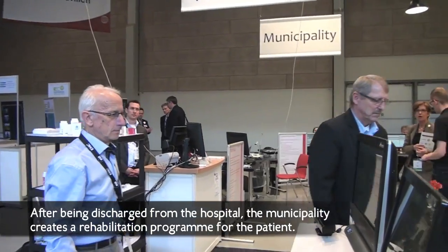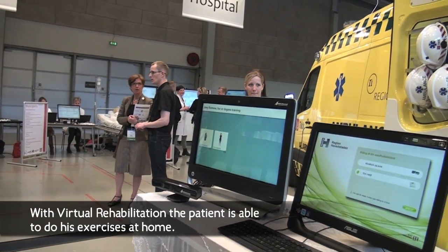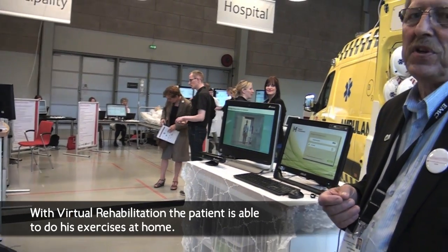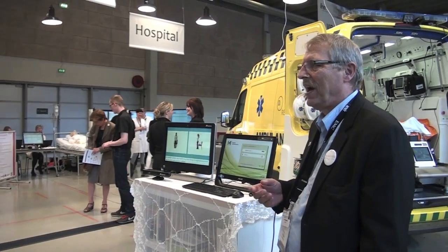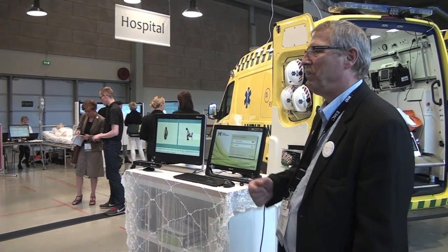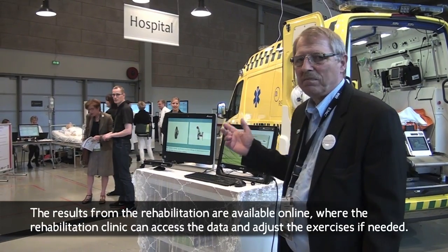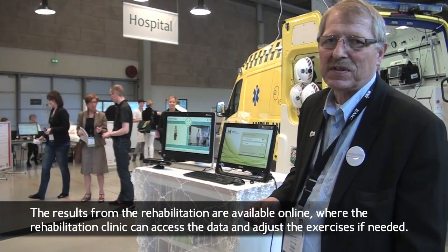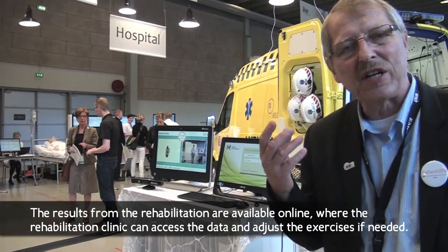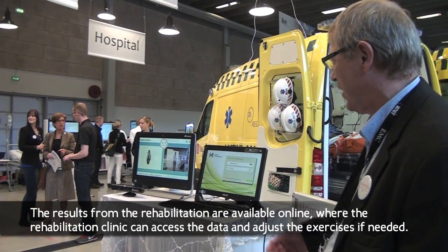Goddag. Her er dagens træning. So the patient and the physiotherapist have agreed which exercises should be done, how often they should be done, and how they should be done. So now the patient at home is doing the exercises and being monitored by the computer system to see whether or not he performs at all the exercises or whether he's doing it correctly.